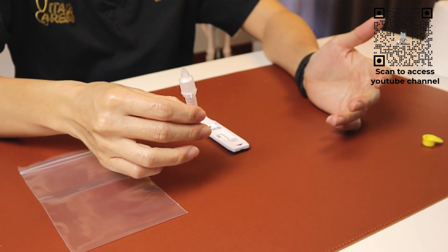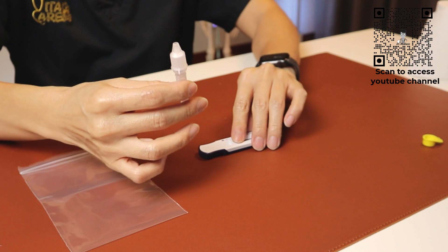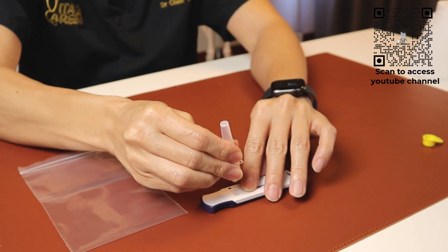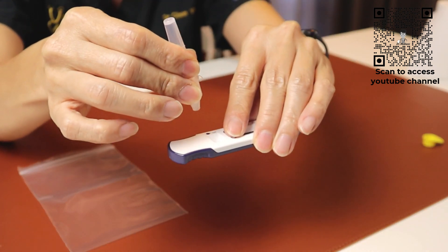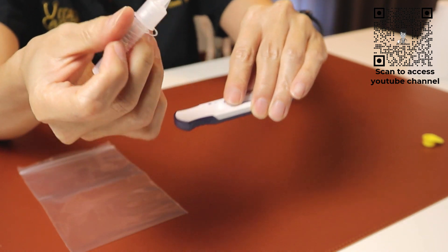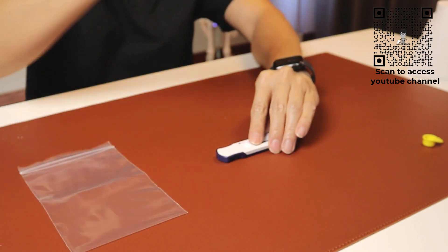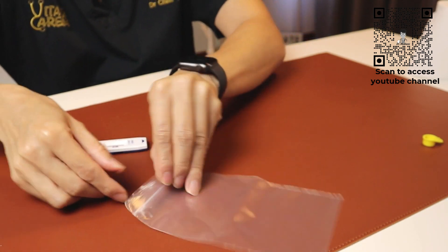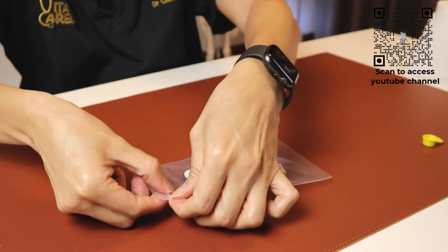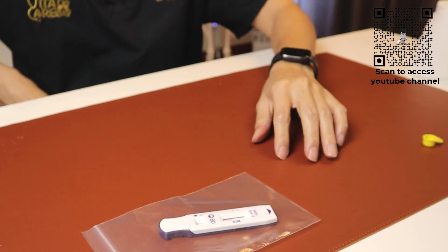The kit that I'm using comes with a test cartridge with a well. I'll cap up the reagent bottle and drip three drops into the well, following which I'll throw the reagent bottle away. Place the entire test kit strip or cartridge into a ziplock bag, and we will wait for 15 to 20 minutes.